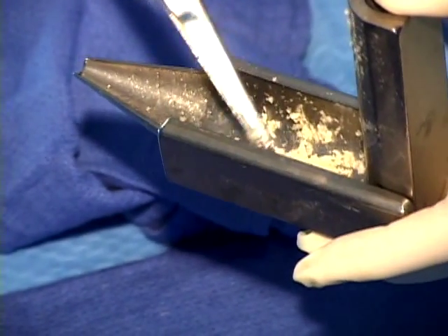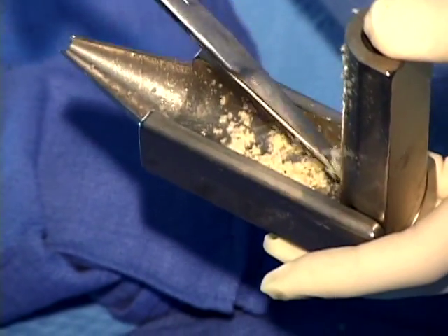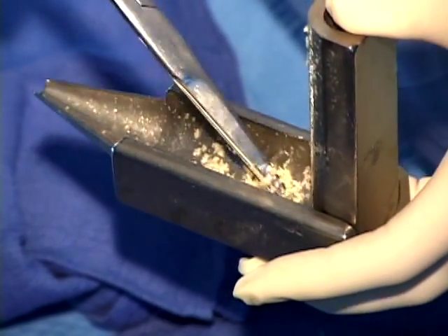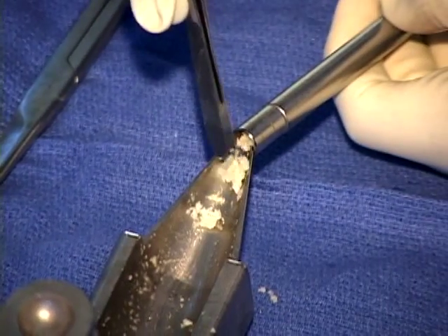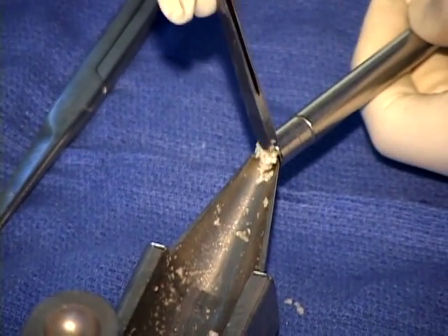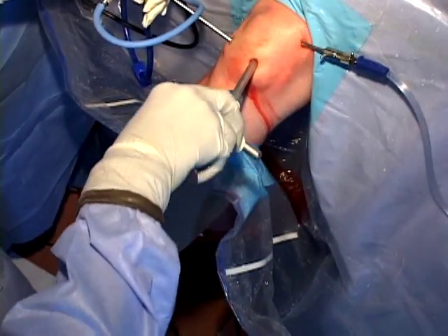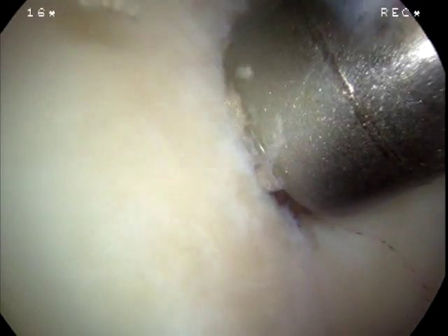Efforts to add fibrin glue, cellulose, or other adhesion factors to this paste have not been successful in that they have created a bone plug. Once the paste has been formed it is reinserted into the trephine. The trephine is then brought back into the knee into the prepared lesion and the graft is impacted into the base of the lesion.